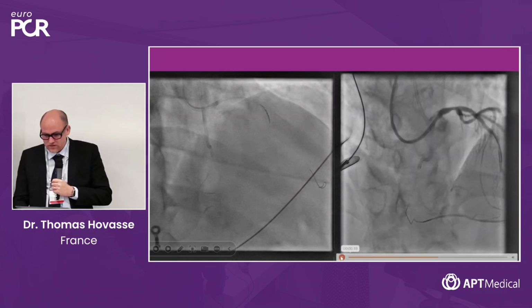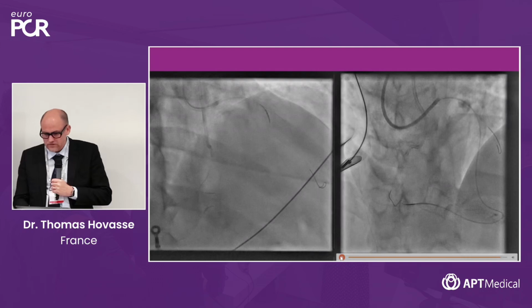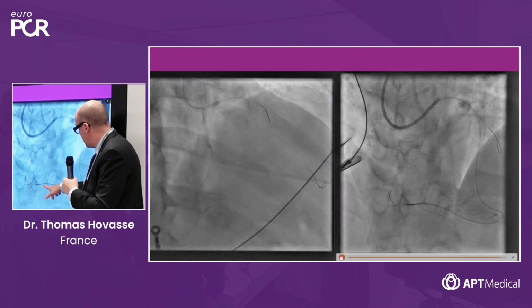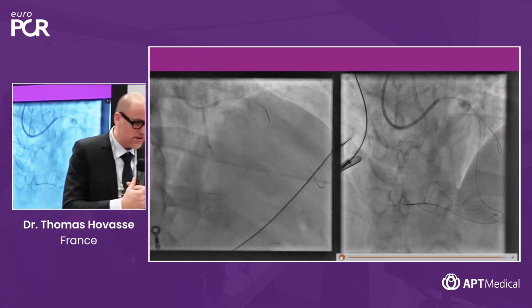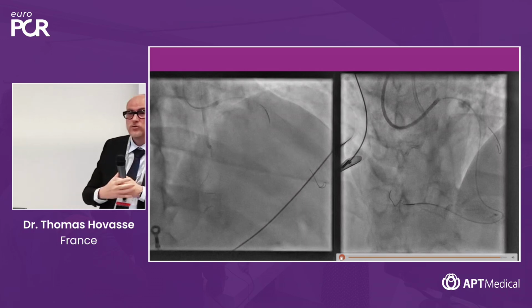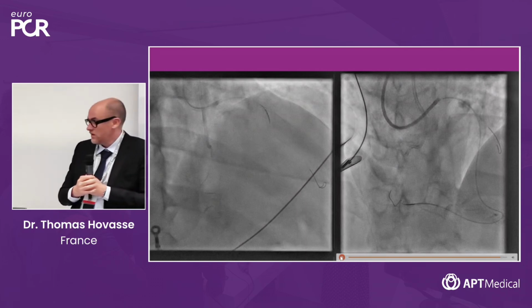So you're here now. I will freeze the image here. So you have your first wire here, here the second wire. So what could be your solution now to solve the case? Which wire will you use, retrogradely, antegradely? What will you do now? What is the wire? Which guide?